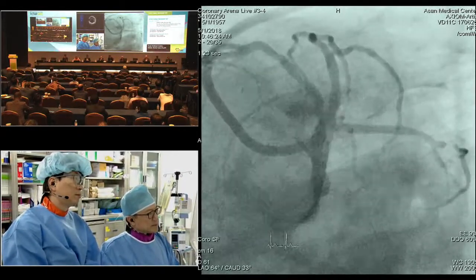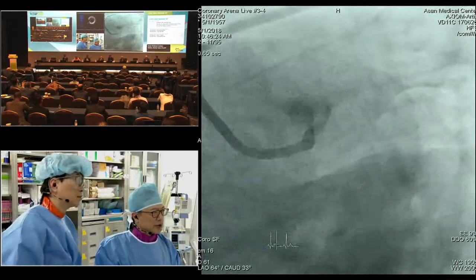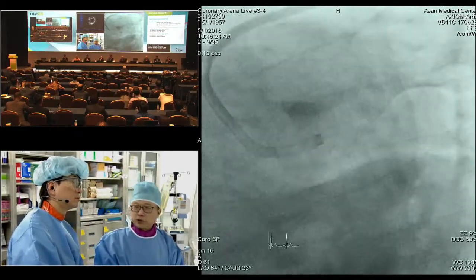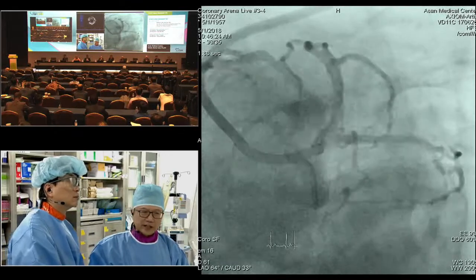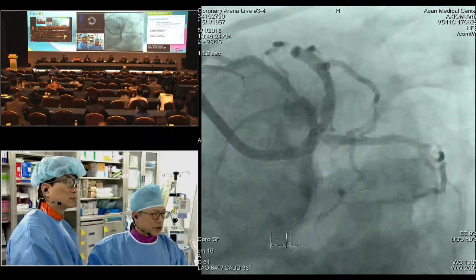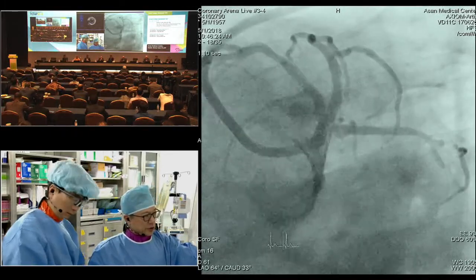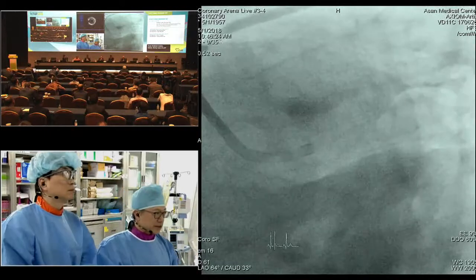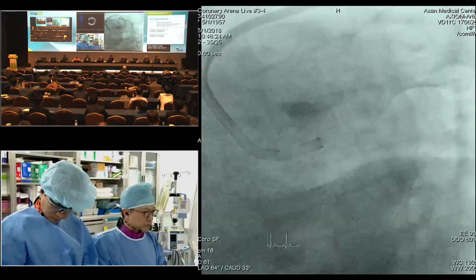So what are you going to do? We're just going to protect it provisionally for now. Just do the proximal LAD left main, and then we'll see what the circumflex looks like, because from IVUS, it doesn't look too tight. Yeah. And therefore, in the circumflex itself, we actually want to fix the distal lesion first, because once we put a stent in the left main, it's more complicated, obviously, to fix the circumflex. So we did that already when we came and we can show that to you.